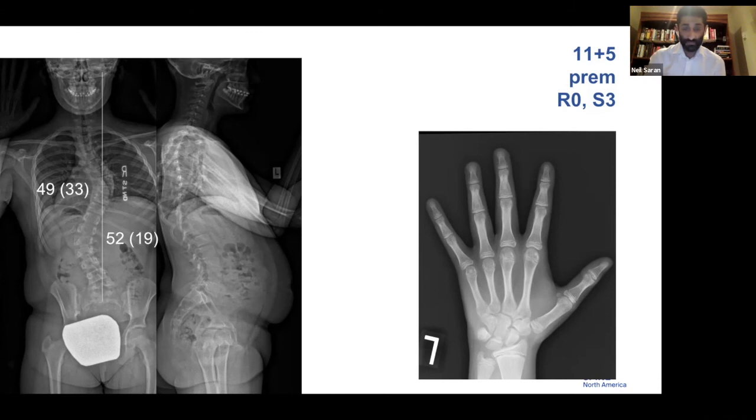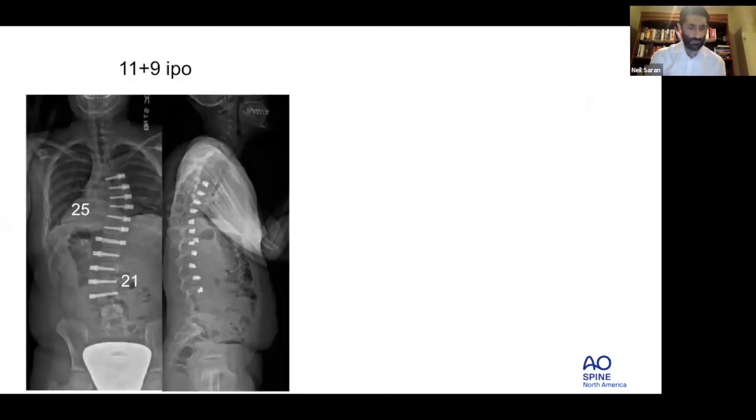And so this patient chose to proceed. We went ahead and did a double tether. Typically I do these over 2 or 3 days, so I'll do one day and another one the next day or 2 days later. This one I actually happened to do all in one day. It makes for a long day. And the tricky thing sometimes is you have to make sure you can offset that screw where you're transitioning from the right side to the left side, but it's actually a lot easier than you think.